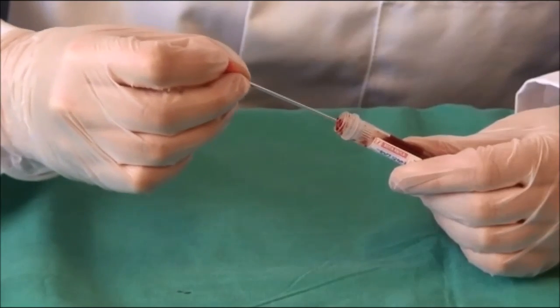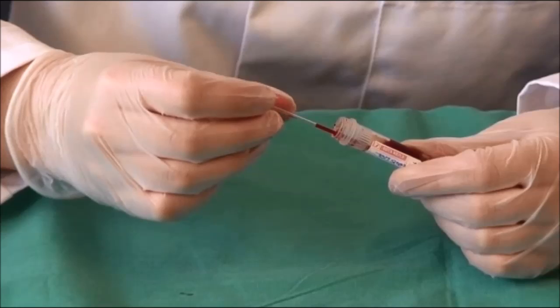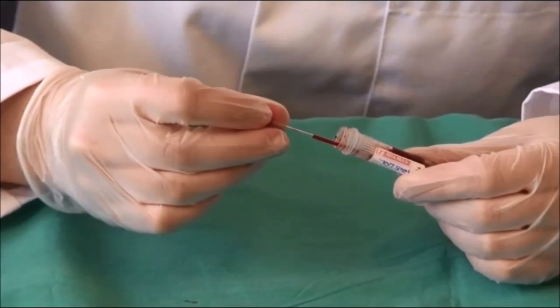Holding the blood sample at an angle of about 45 degrees, insert a capillary tube and allow the blood to be drawn up via capillary action to about three quarters full, before carefully placing your index finger over the end in order to remove it from the blood sample.